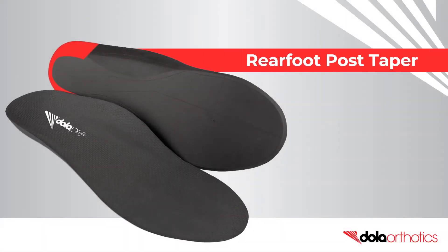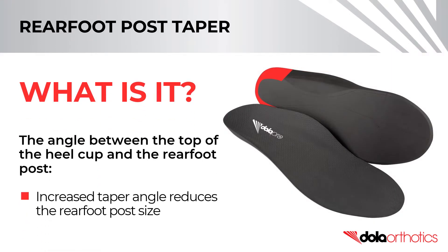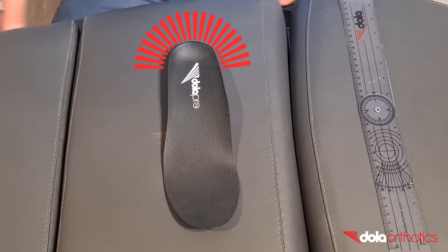How to customize your Dollar Pro with a rear foot post taper. A rear foot post taper is an increase in the taper angle to reduce the rear foot post size. In this video we'll show you how to complete a rear foot post taper in clinic.